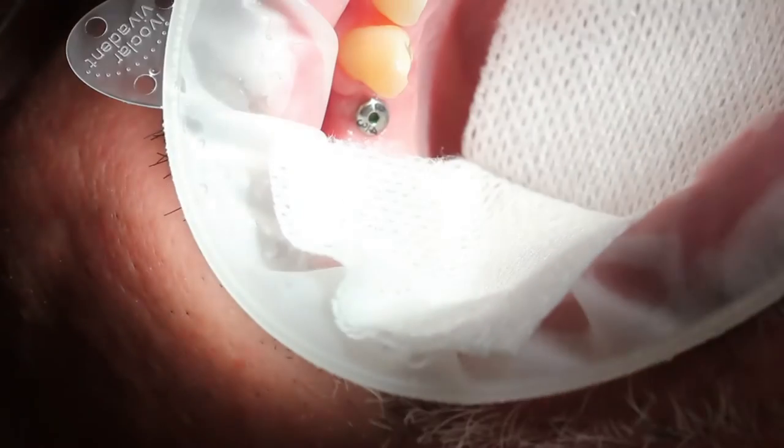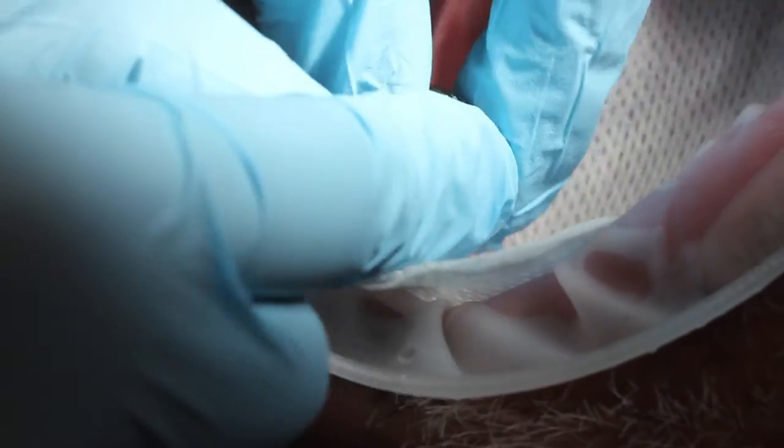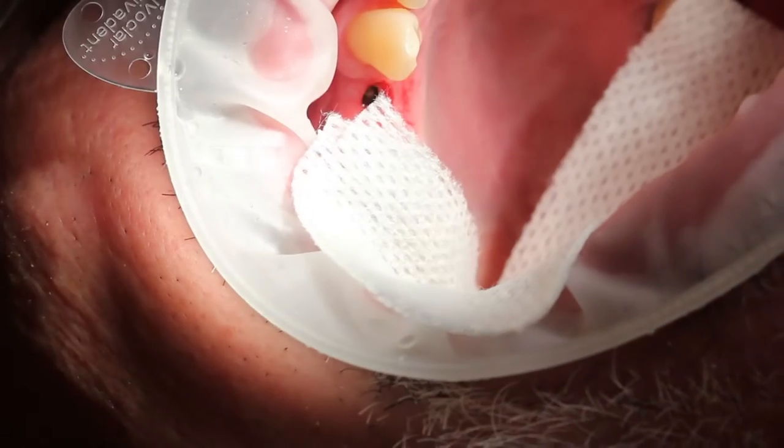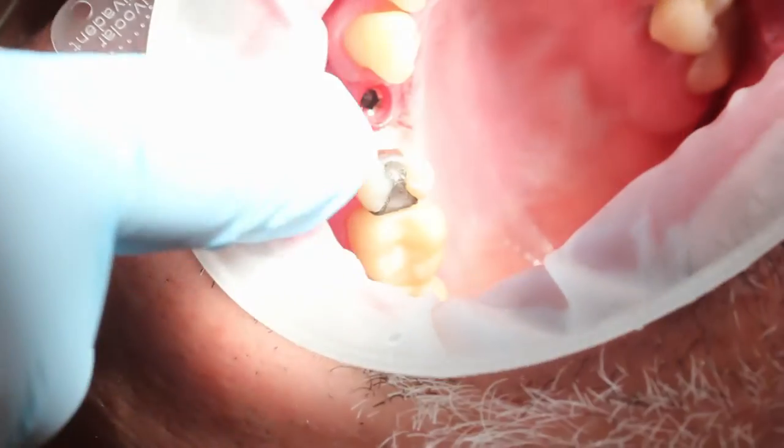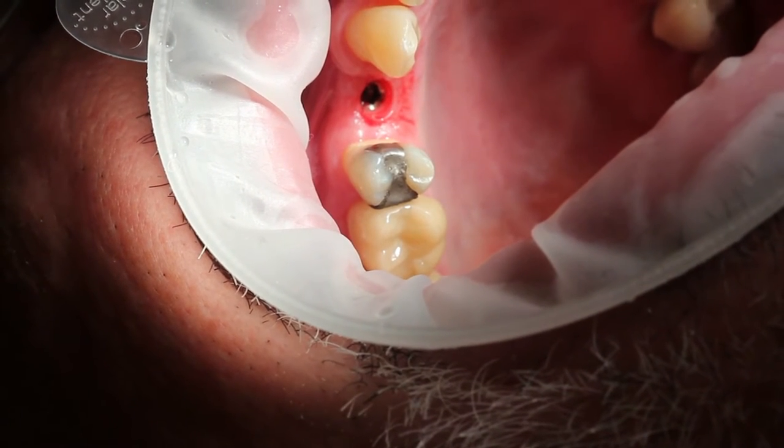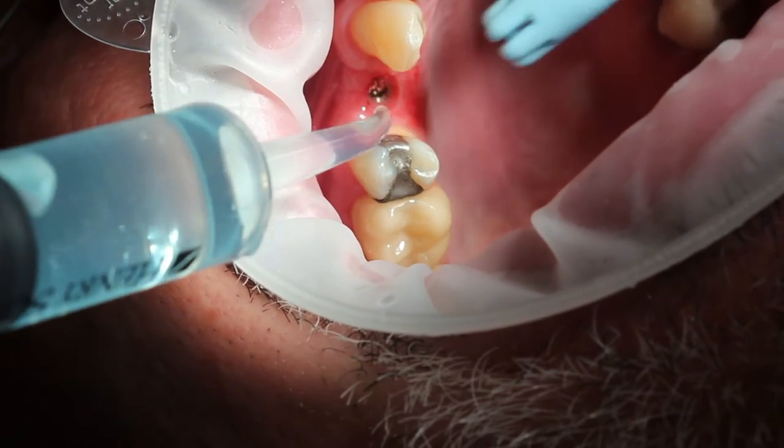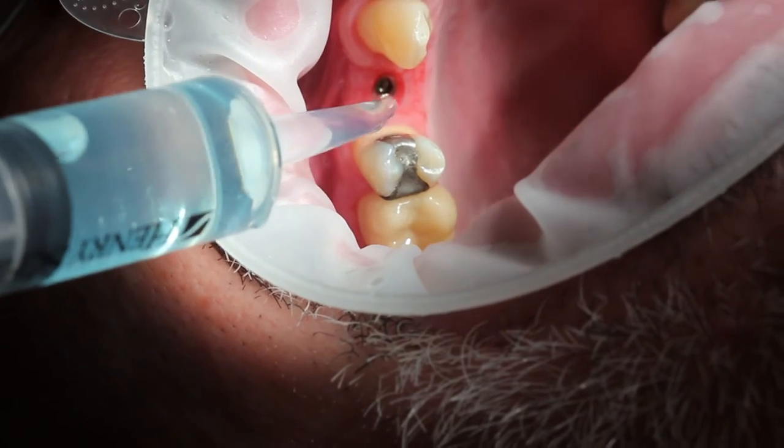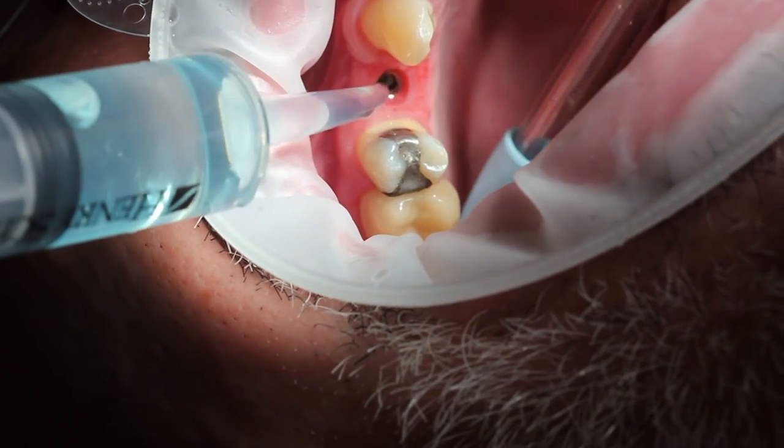The first clinical step will be to remove the healing abutment from the implant. Place a throat pack to catch anything that may fall in the back of the throat. You're going to use your driver to unscrew the healing abutment. Once it's removed, you can use chlorhexidine to irrigate the implant to clean anything that may be trapped inside the threaded portion.